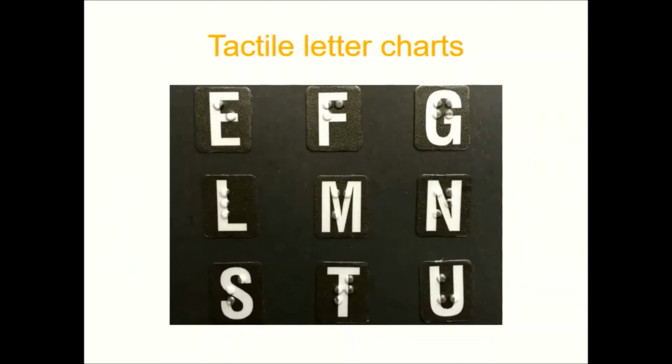You can also experiment with tactile letters. So these particular ones can be bought online and they correspond with Braille, but you can actually try making your own. So you could use Velcro to form a letter tile that someone can physically feel the letter. You could use pipe cleaners to do the same thing. Have a think about that, and if you need any more support, just get in touch with us.